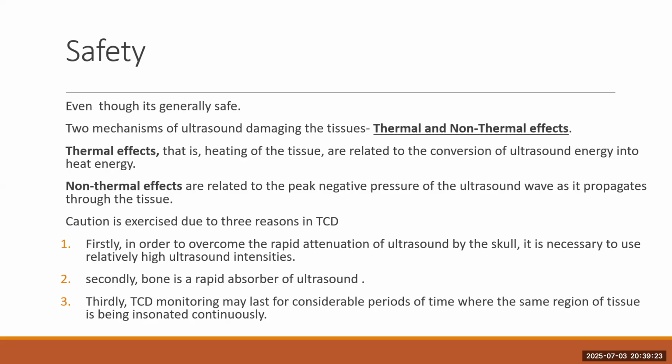And third, when we employ a headset in the non-imaging Dopplers, we tend to keep it for a reasonably long period of time. Let's say if we are monitoring vasospasm in SAH patients, we tend to keep it for more than an hour, or if there is no time constraint regarding shifting of the ultrasound probes, we tend to keep it on the patient. So continuous monitoring by itself can lead to these thermal effects.